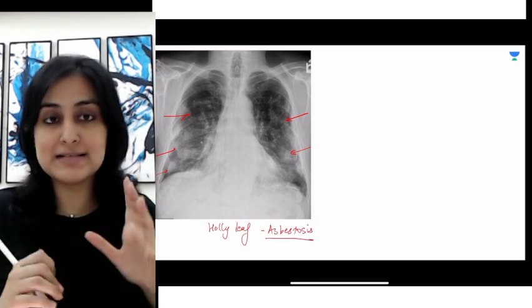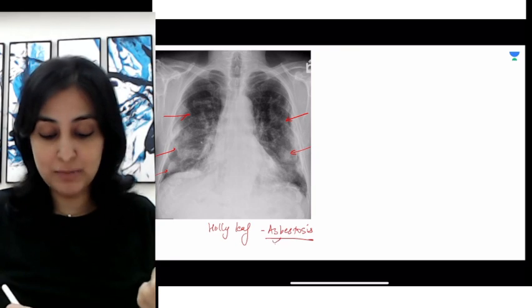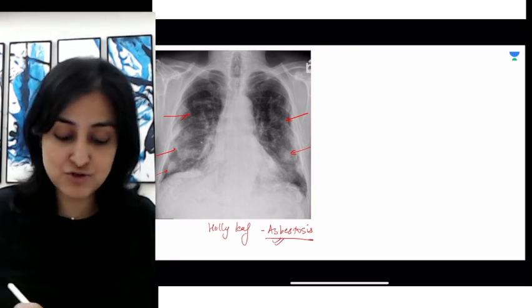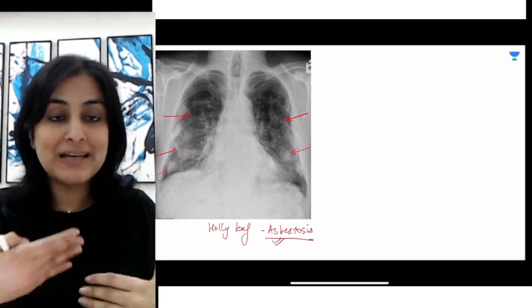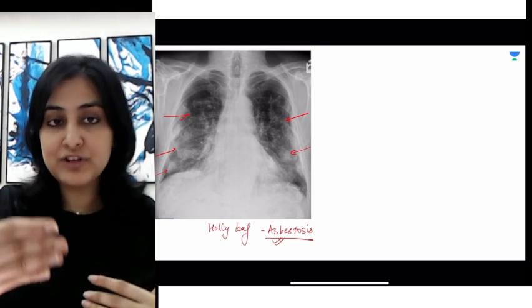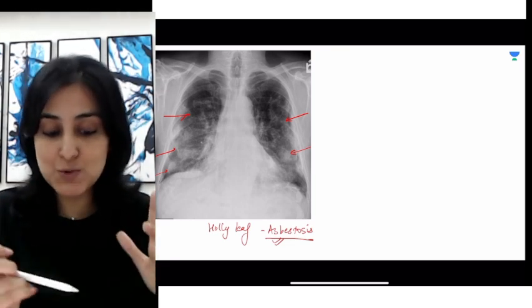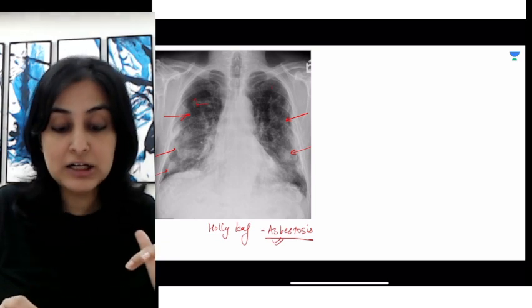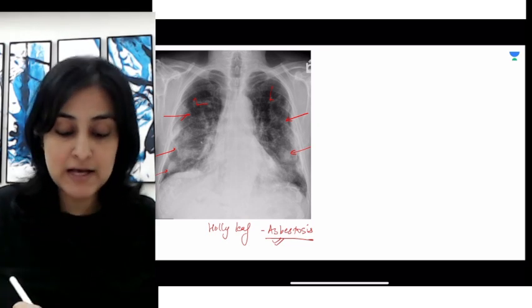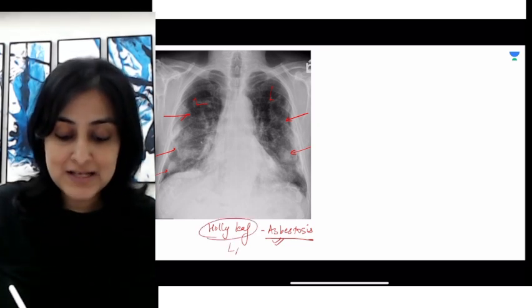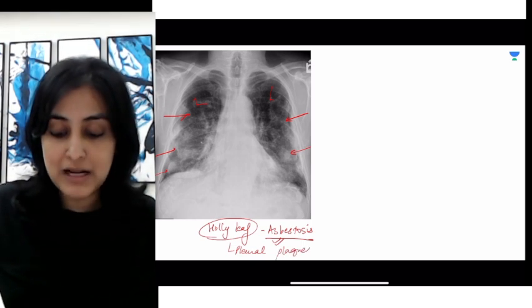The holly leaf sign is seen in asbestosis. These calcified opacities are nothing but pleural plaques. Remember, the most common finding in asbestosis is actually pleural plaques which eventually get calcified. Because X-ray is a 2D projection, the anterior and posterior pleural opacities are superimposed on the lung fields, which is why they appear as if they are in the lung parenchyma, but they are actually in the anterior and posterior pleural surfaces. So the holly leaf sign represents calcified pleural plaques.